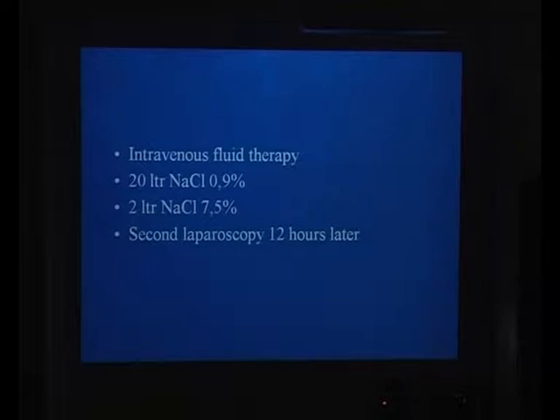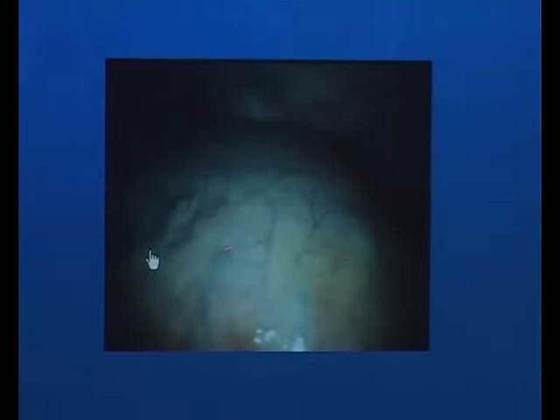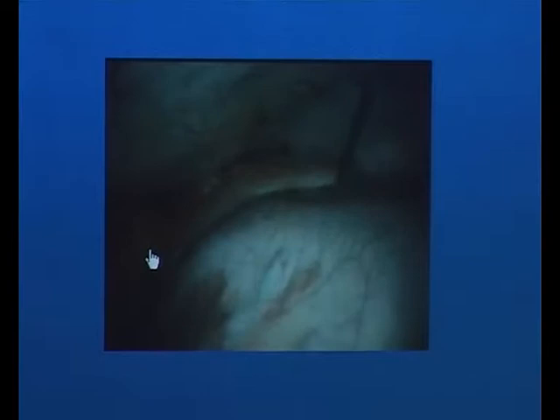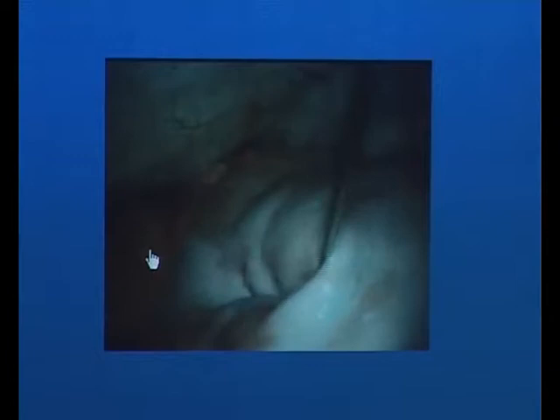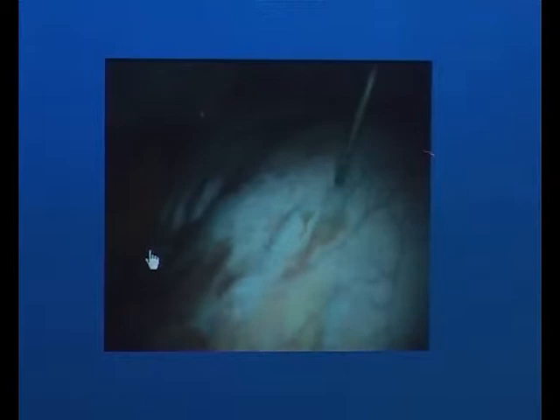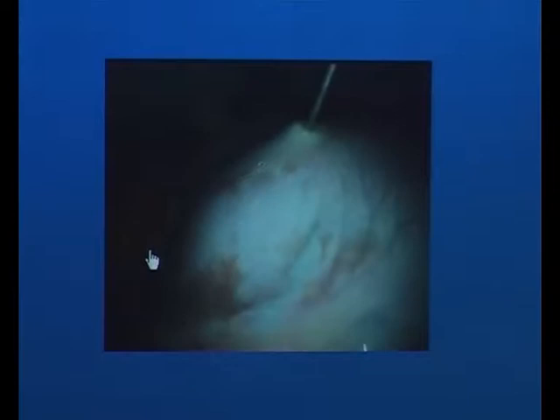And then we look at the abomasum here on the right side. You have seen the liver, you can see the omasum, and you can identify the net part of the abomasum with strong blood vessels here and the beginning of the gray surface of the abomasum. It's now possible to bring gas into the abomasum, or to fix the abomasum directly if there's fluid in it. Now you can see the beginning of the pylorus part of the abomasum, and we puncture and fix it, from the second to the third part of the fundus of the abomasum, and in this position we can bring in the toggle.